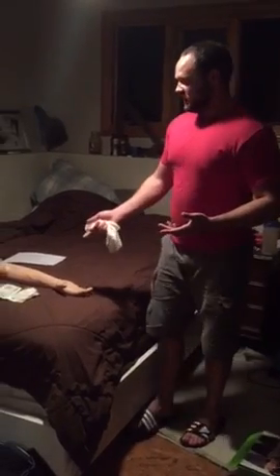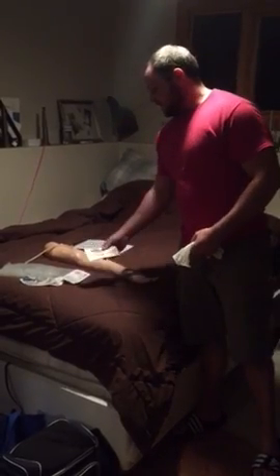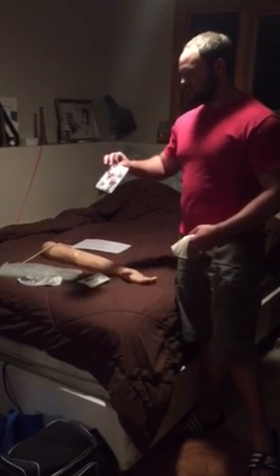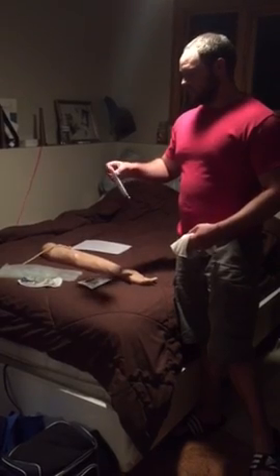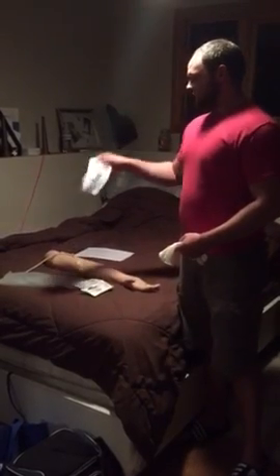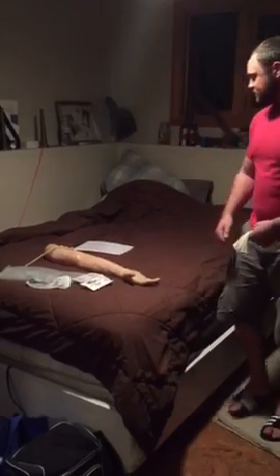We have the supplies sitting here on the bed. Here is our dummy arm to actually do the stick. Here is our IV start kit. Here is our catheter, and this is actually kind of a unique catheter. It depends on whether or not you're supplied by your hospital to have them, but not everybody has these type of catheters. And then we have tubing, and finally we have the actual fluid.